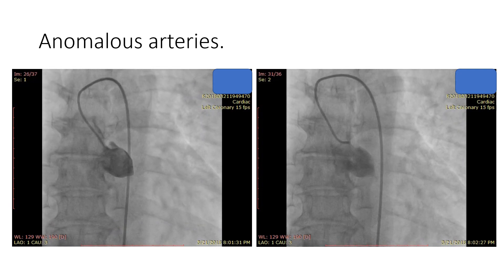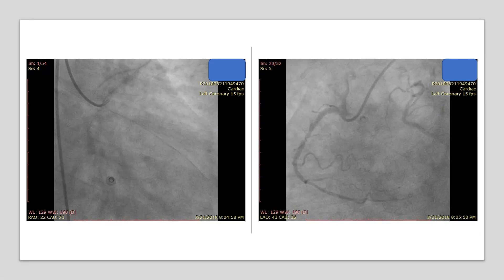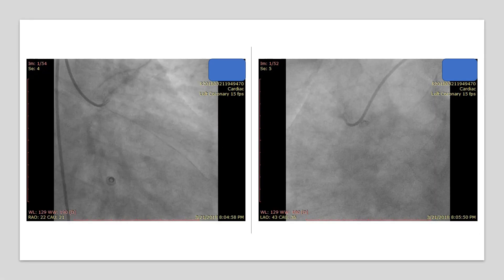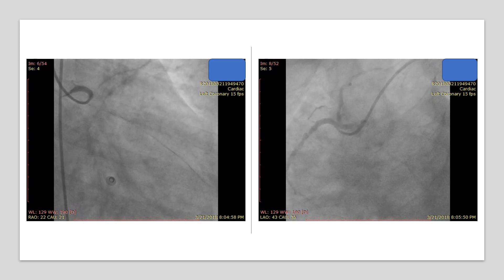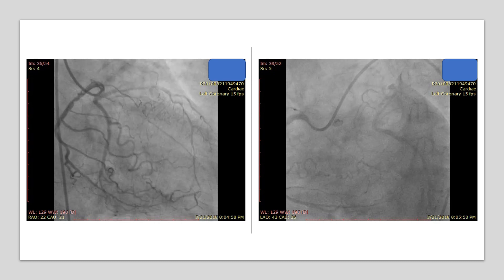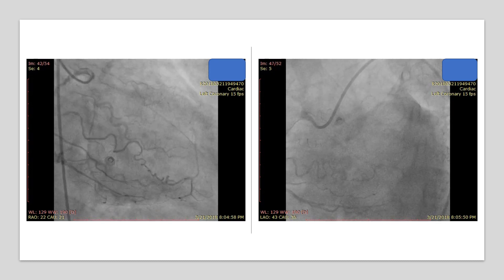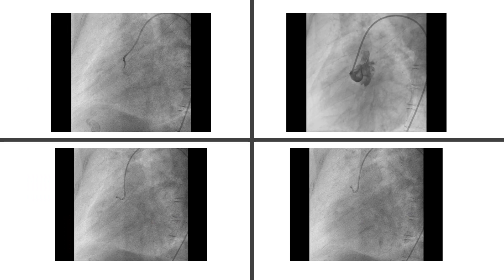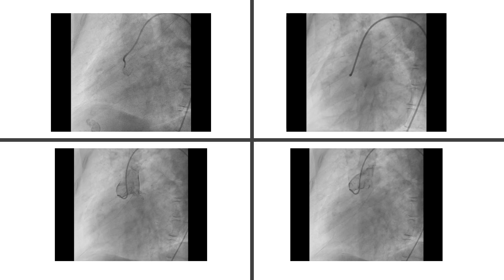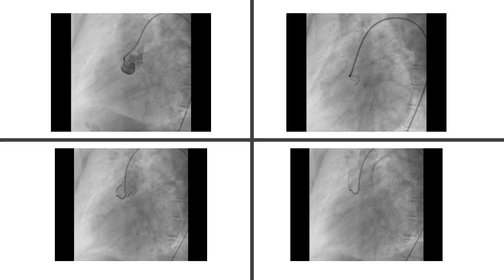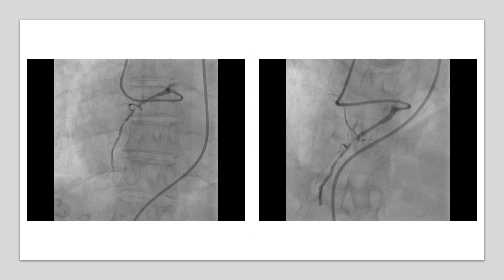In this case, the left system could not be engaged. Injection into the RCA showed anomalous origin of the left system. This is a strange example. In other cases, you can see the left main stem arising from the right sinus of Valsalva. In another example, the operator struggled to find the RCA, and it turned out to be arising near the left main stem.